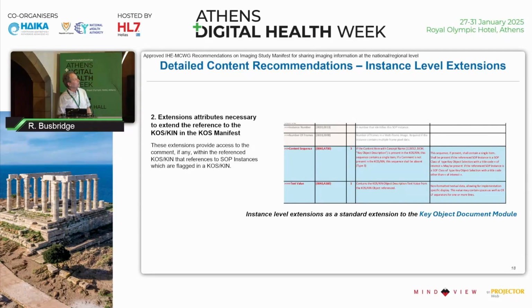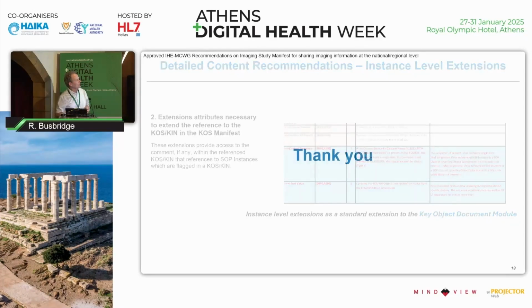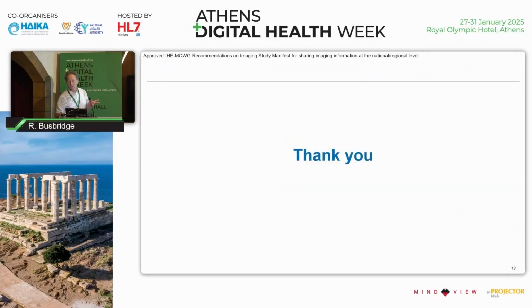So that's a fairly small addition, a recommendation to add some attributes to the manifest, but the purpose and the benefits from doing so, I think, are fairly significant. Sorry for the pun, in the sense that it will allow you to identify significant images without the necessary overhead of retrieving additional items. So that's the two sections I was going to cover, Charles.